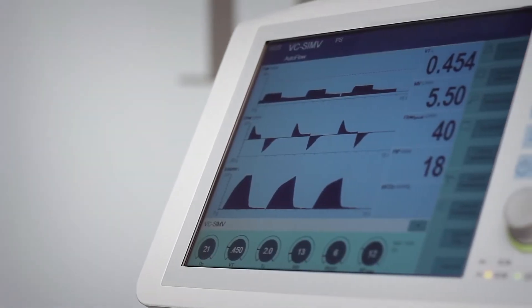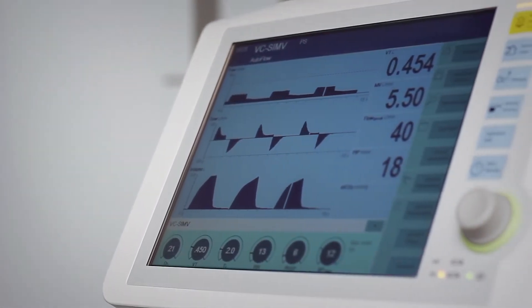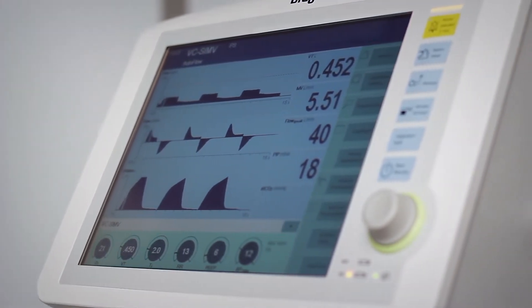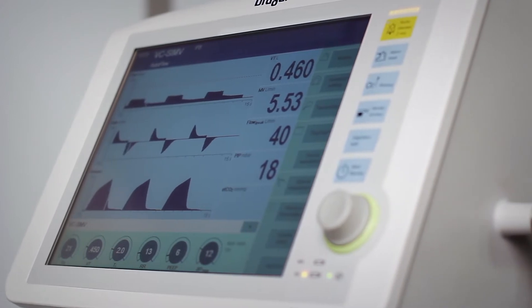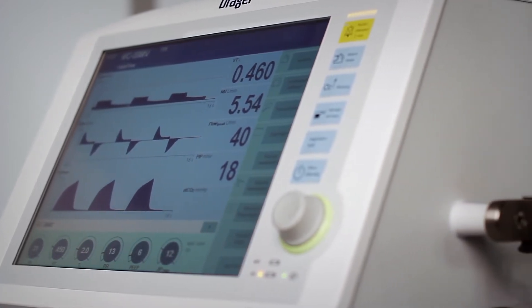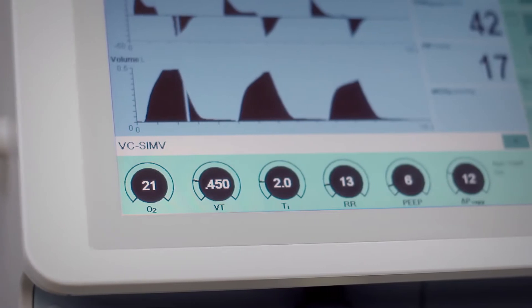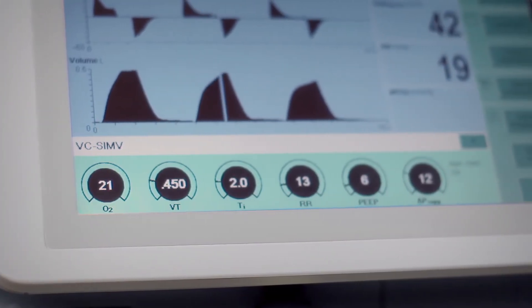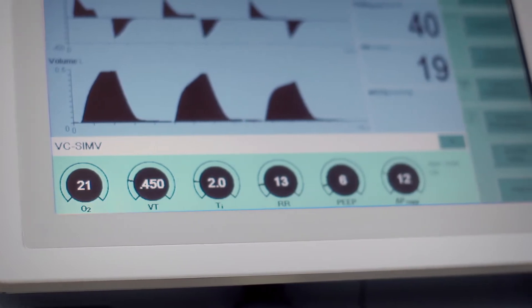Before using the device on a patient, readiness for operation of Savina 300 is checked during the device check and the breathing circuit check. Only start ventilation once the device check has been successfully completed. The device check is quickly and easily performed. Savina 300 guides the user through the respective test steps in the form of a question-answer dialog.